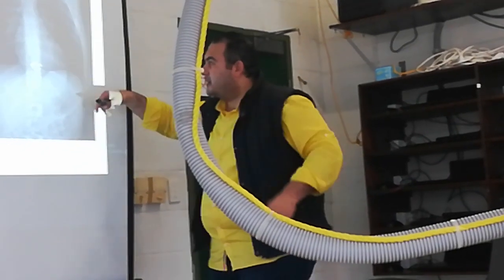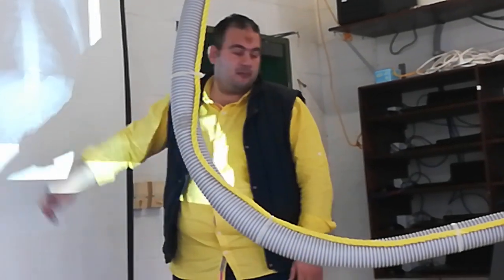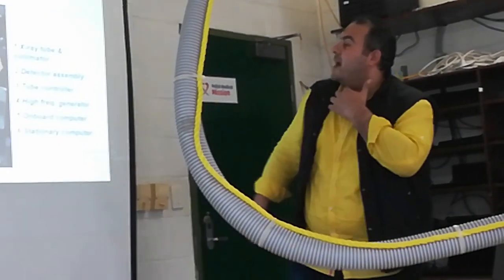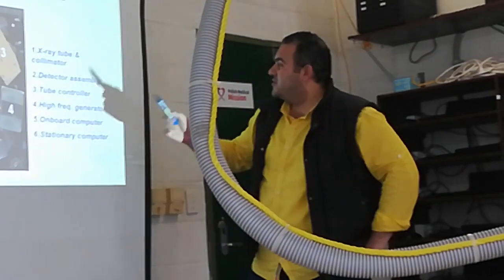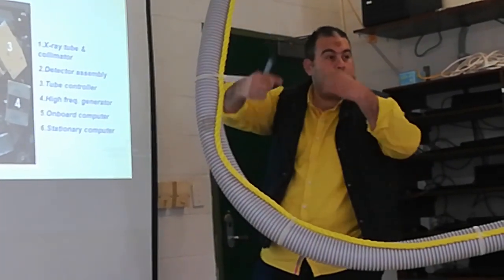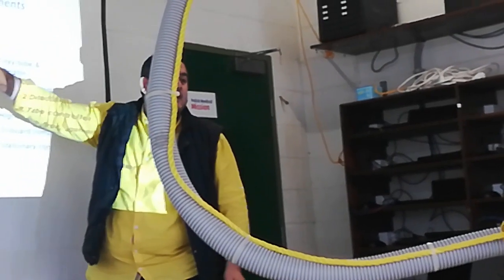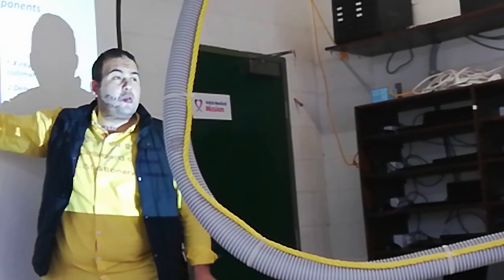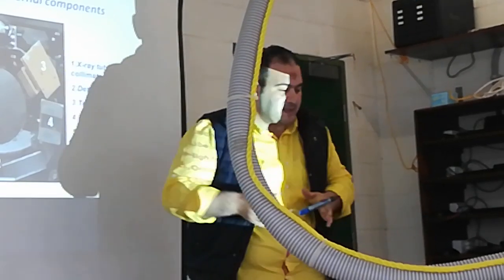Here is the X-ray source. You will find here bones are high density, bright, and you will find lung black. This is the CT gantry from inside. Number one is the X-ray tube, two is the detectors, and three is the tube controller, which controls the tube. Four is the high frequency generator, five is the onboard computer, which controls all these components inside the gantry, and six is a stationary computer which controls the onboard computer from the console computer outside. This is from inside.